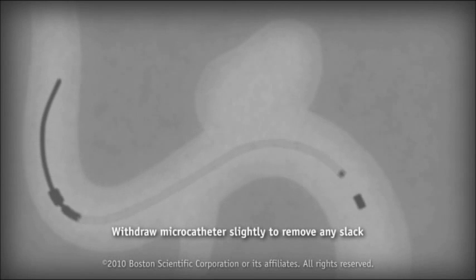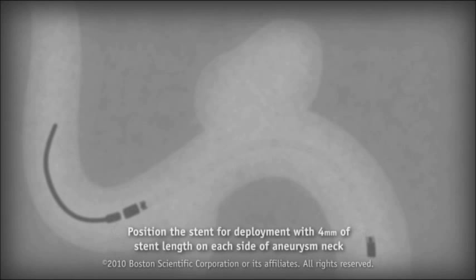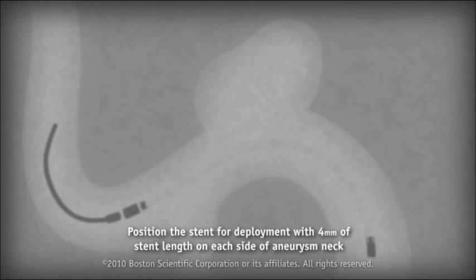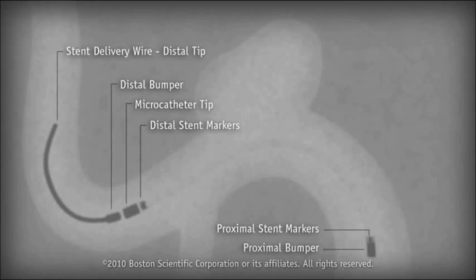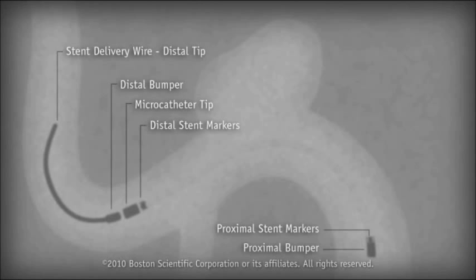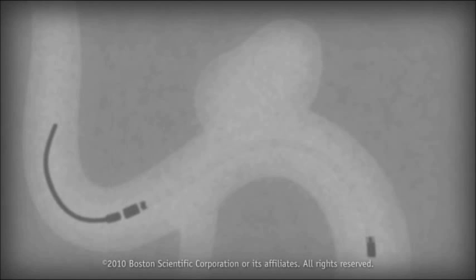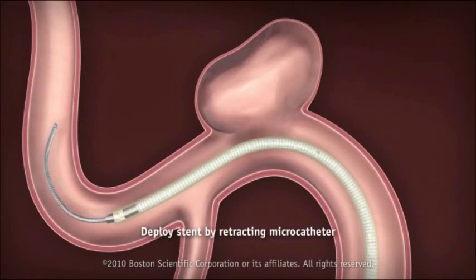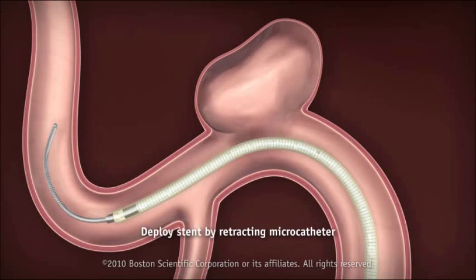Withdraw the microcatheter slightly to remove any slack. Position the stent for deployment by aligning the stent markers across the aneurysm. Maintain approximately 4 millimeters of stent length on each side of the aneurysm to ensure appropriate neck coverage.